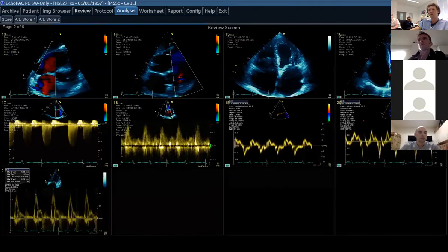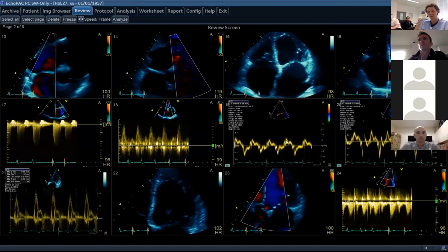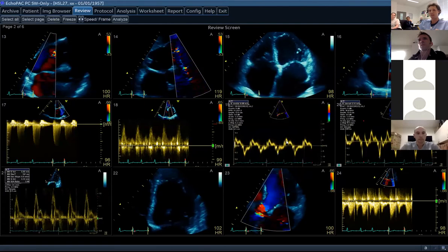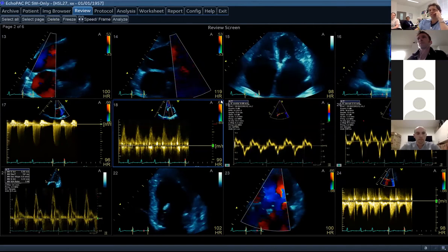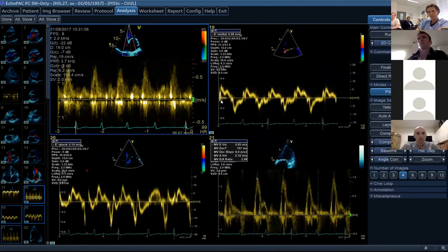So Lee, if we're worried about raised left atrial pressure and a potentially volume overloaded state, what other measurements would you want to have a look at? Let's stick with the left atrium, left atrial pressure. What other measurements would you want to assess for left atrial pressure elevation? You could look at the Doppler from the pulmonary venous return to see if, during ventricular systole, you get flow reversal up the pulmonary veins, which is a marker of severe mitral regurg.